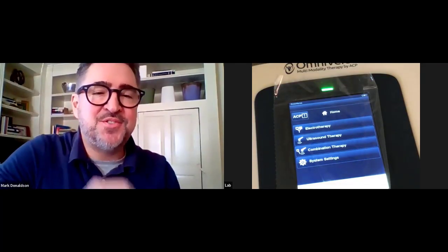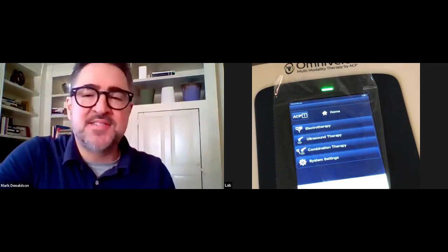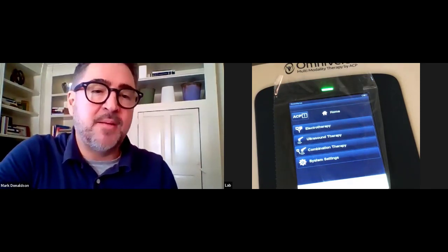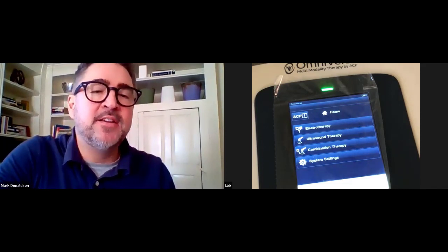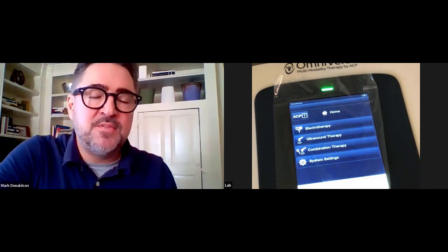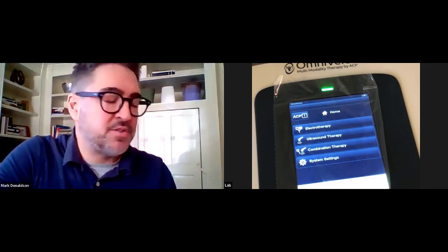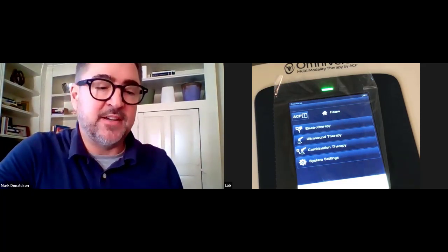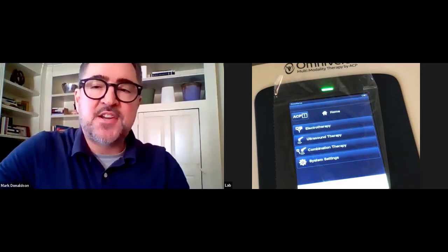Thank you everyone for taking the time to view this lab section for wound healing. Today we're going to focus on a couple of different things: electrotherapy uses — one being pain management related to a wound, one being high volt sensory related to wounds — as well as the setup for ultrasound treatment for wound healing.